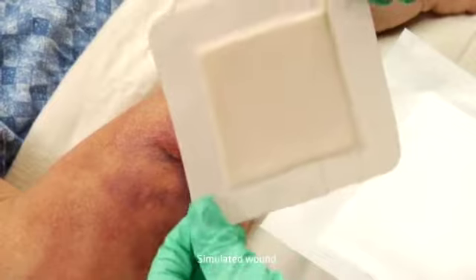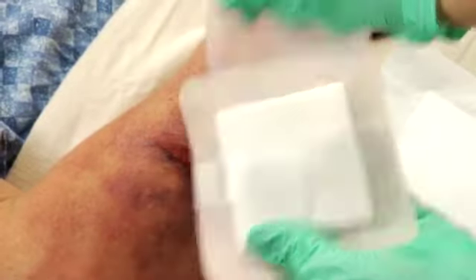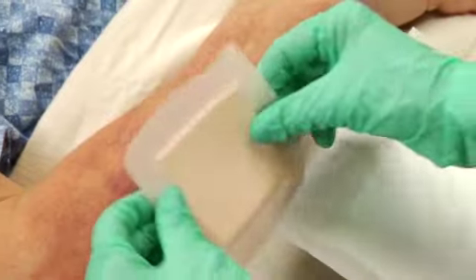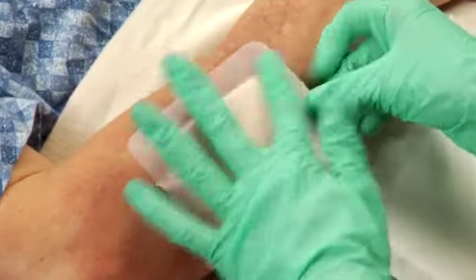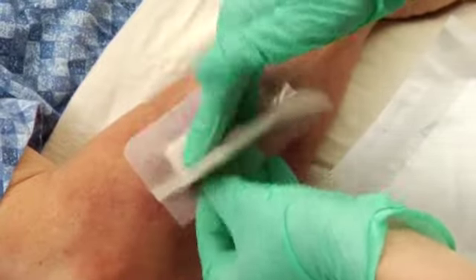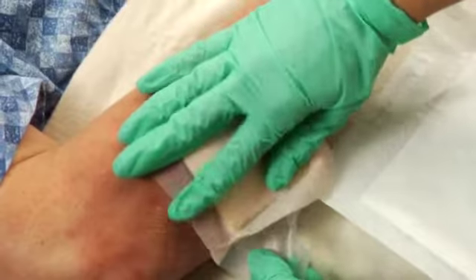To apply, remove Optifoam Gentle from the package, then remove one piece of the release liner. Place the dressing on the wound, then remove the other release liner. Gently secure the dressing to the skin.